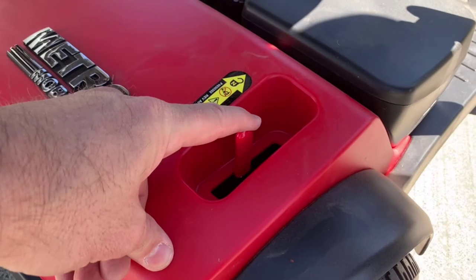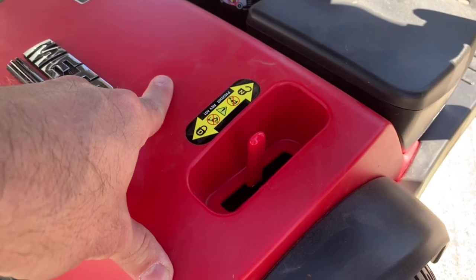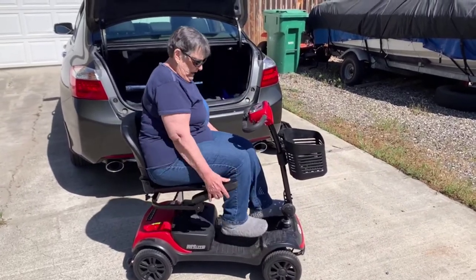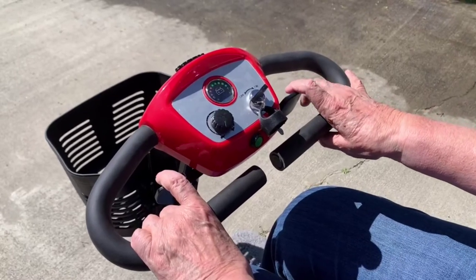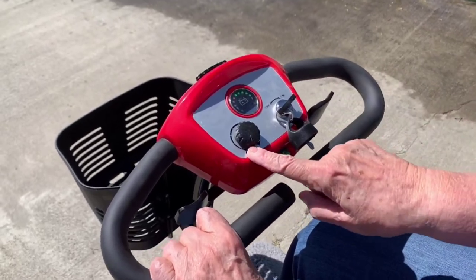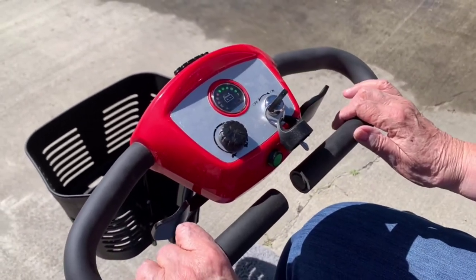I'll show you how well it drives. One thing you have to do is make sure you pull this lever down after you assemble it so it's in the locked position. Because if it's in neutral, you can roll it really easily. The left paddle is what takes you backwards, the right one goes forward. Then the speed dial — you can turn it from slow, the turtle, all the way to fast. And to hit the horn, you just hit the green button right below the key.